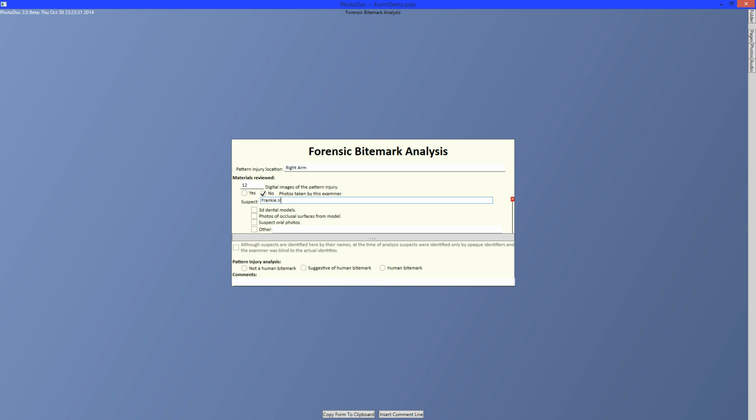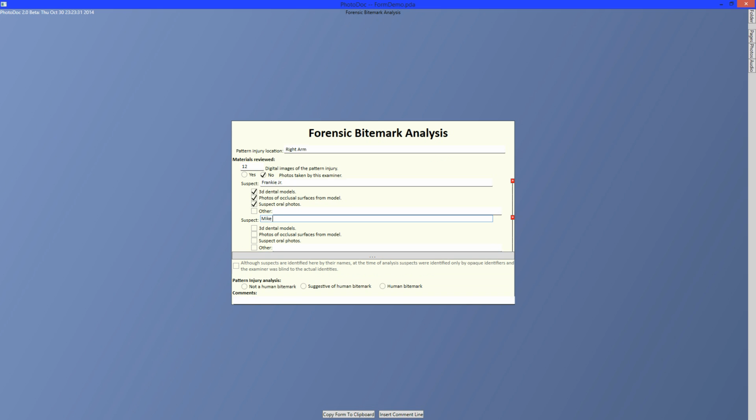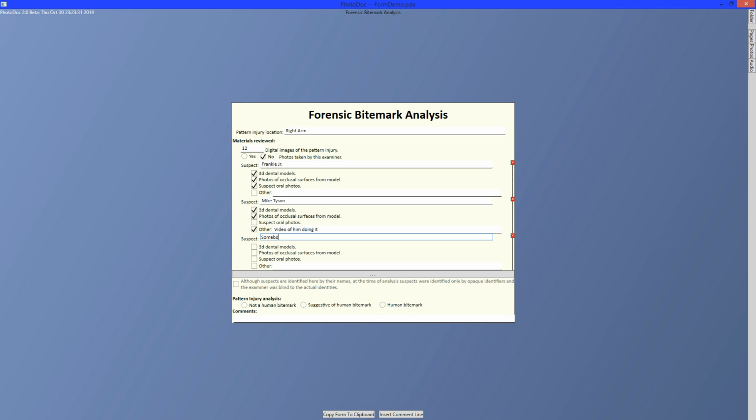Frankie Jr., and I have dental models, photos, and his oral photos. I have a second suspect, who is Mike Tyson. I have dental models, occlusal surfaces, and that video that Paula keeps saying I need to watch. And on somebody else, as many suspects as I have.